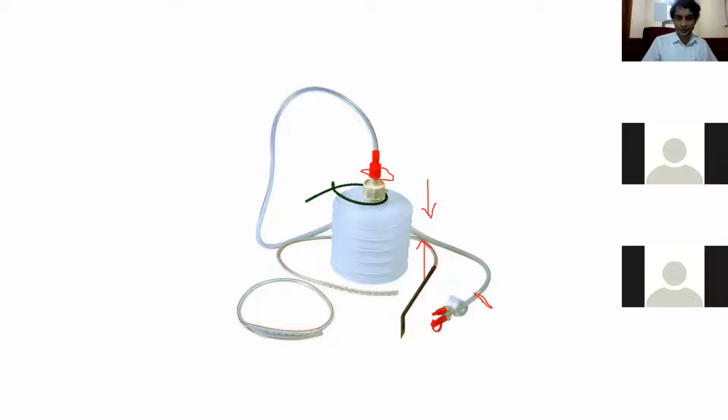And the other side of the drain over here is inserted into the body cavity, right? Or into a wound or whatever, and then it will actively suck out secretions. We tend to put suction drains into subcutaneous incisions.